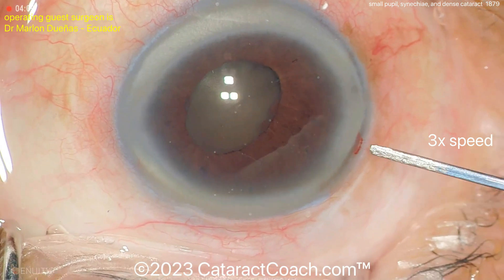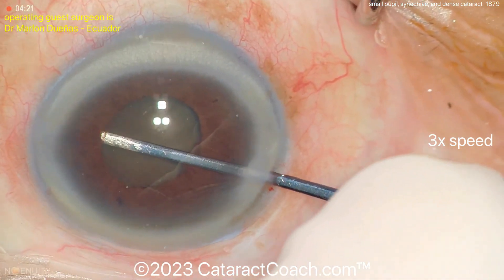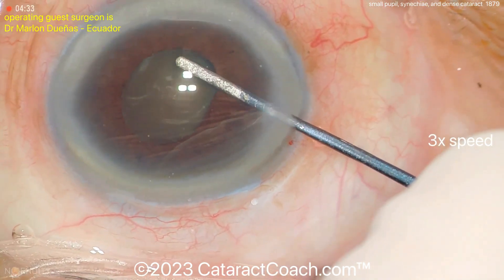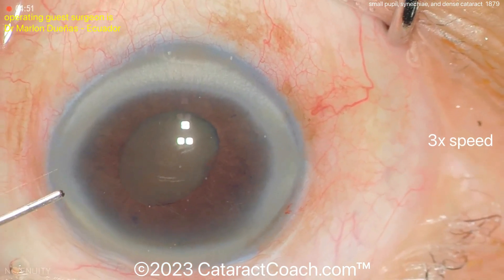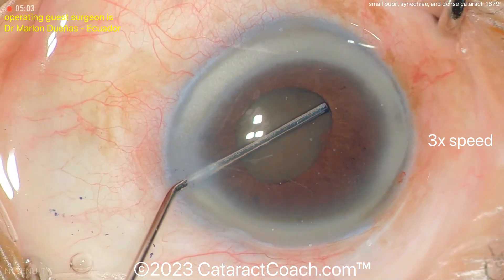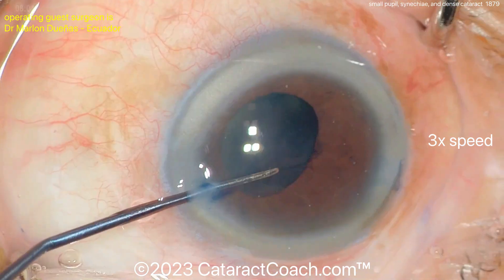You have to do this gently with a blunt instrument because you don't want to damage the anterior capsule. Going in from the other side as well. With a cataract like this you definitely want to put some trypan blue dye to stain the capsule — but remember the viscoelastic may be tough, so sometimes it's easier to put in cohesive viscoelastic, do what you need to do, then wash it out.